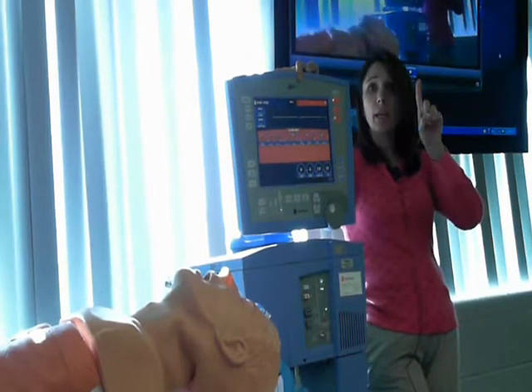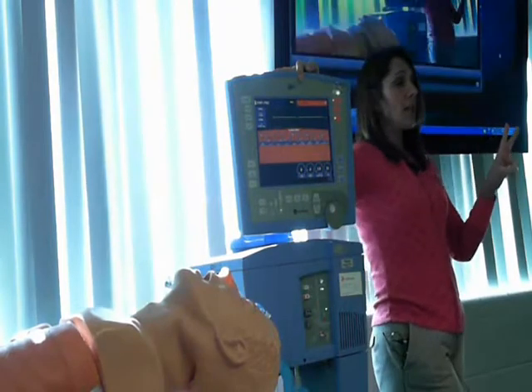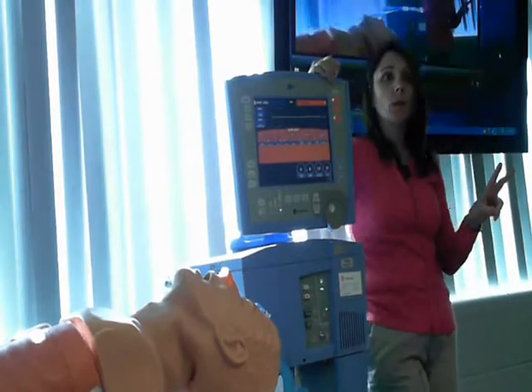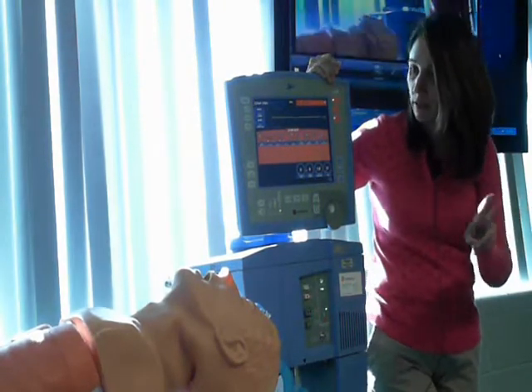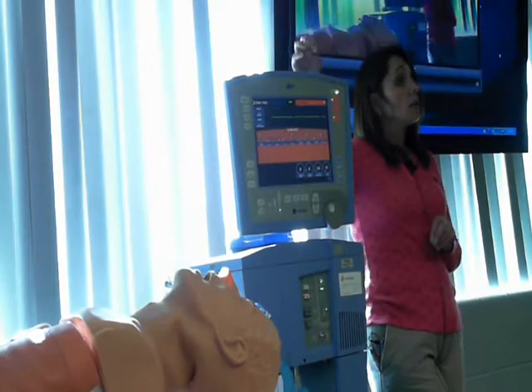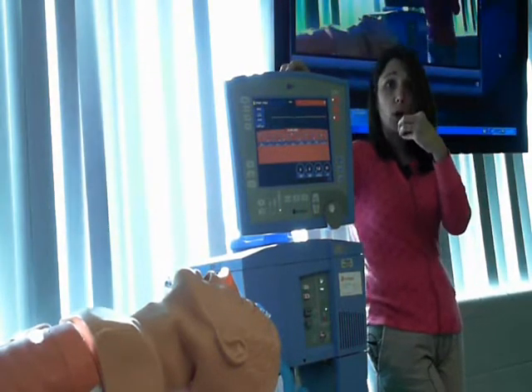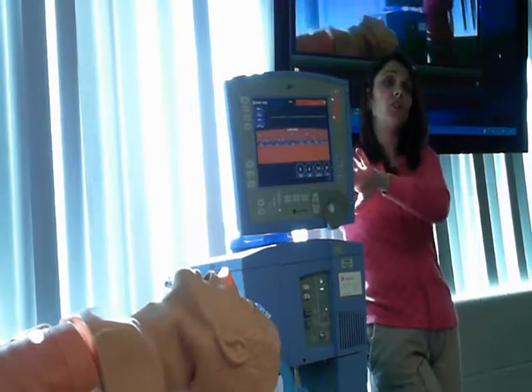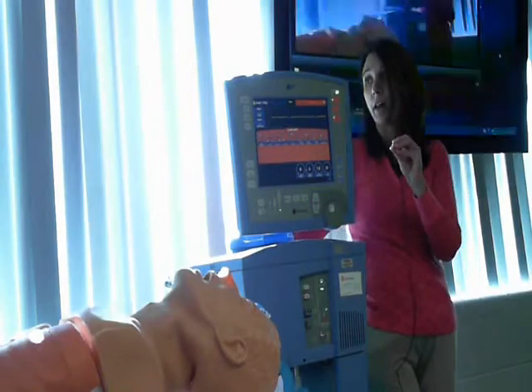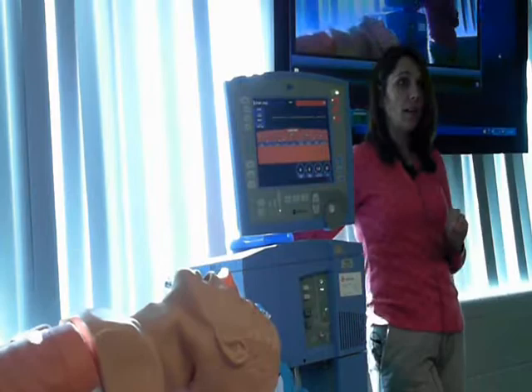The patient must be able to take a breath in and out. They must be able to maintain their own tidal volume. Okay? Now this vent's going to alarm because, well, my patient is not going to breathe, obviously. Okay? So, to do CPAP on its own, without combining it with another mode in mechanical ventilation, you must have a patient who has an intact respiratory drive, who can maintain their own minute ventilation.